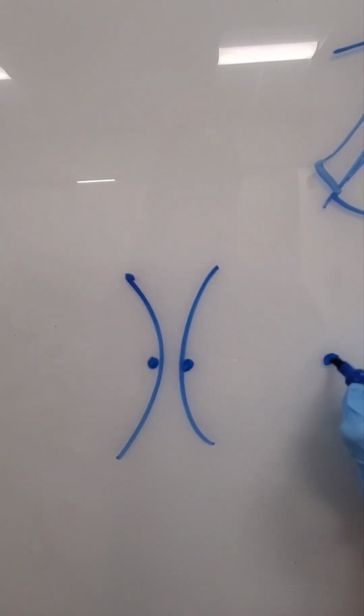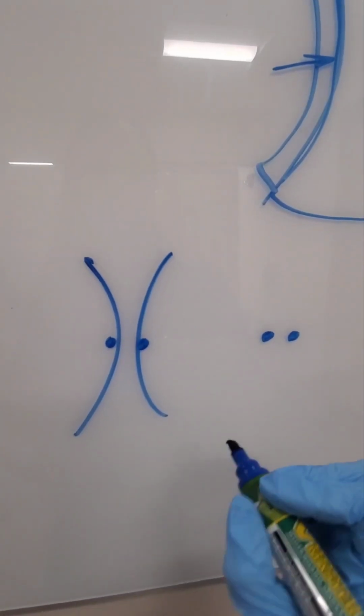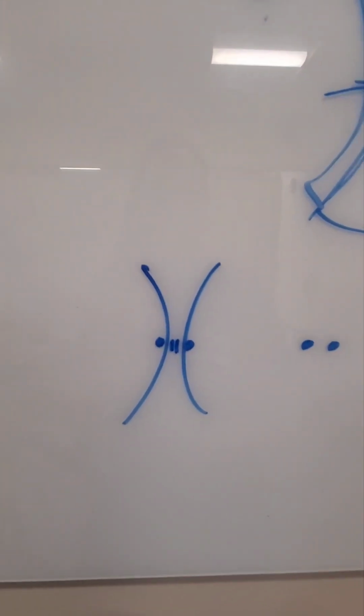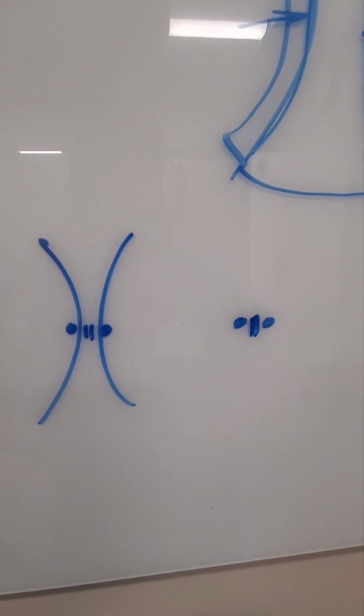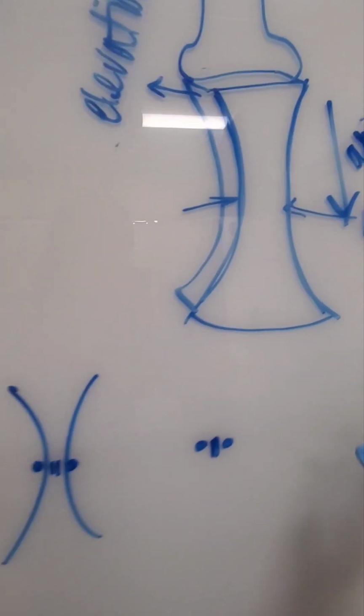My image will have 2 little things there. If, however, the things exist super close together and they're within the space of that sound beam, it's going to look like one thing on my image. They're not resolved. We have to fit our sound beam in between 2 things.